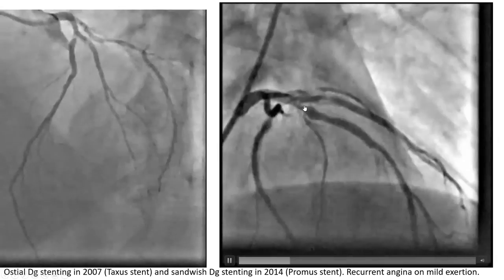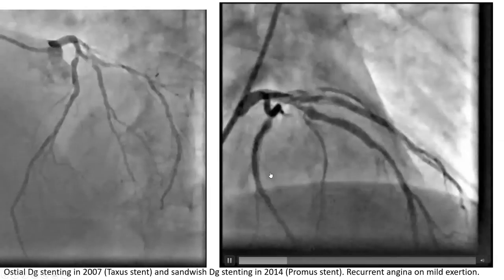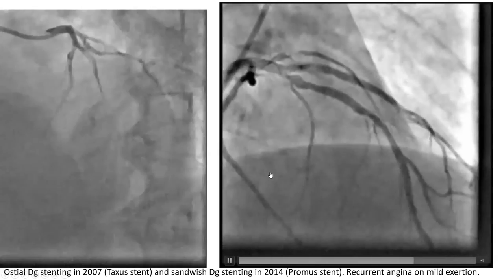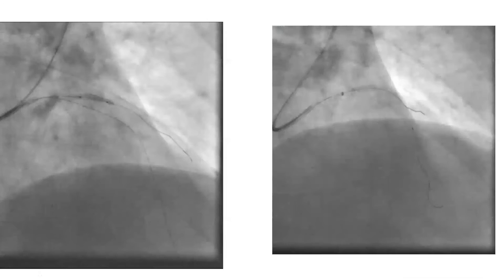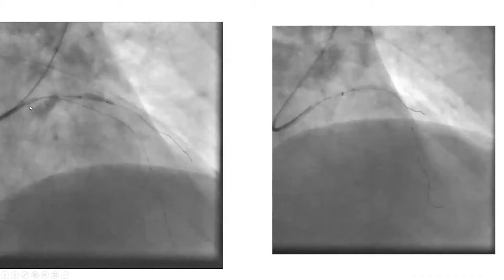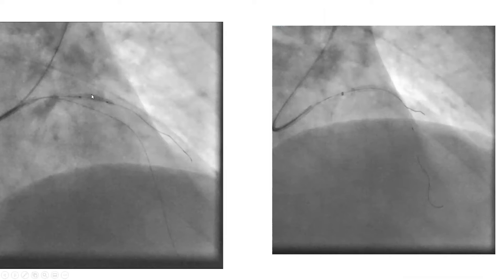We also see stenosis of the LAD just past the takeoff of the diagonal. So we started the case radially. We did the six French Ikari left four guide. We expected the case to be fairly straightforward. Our plan was to double wire, stent the diagonal, then eventually stent the LAD.